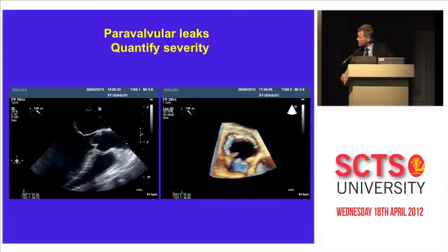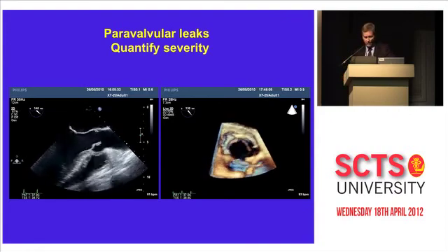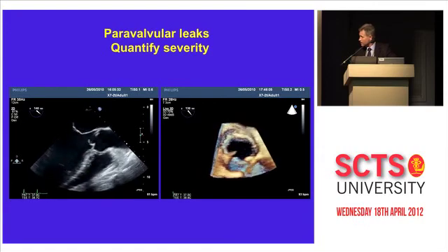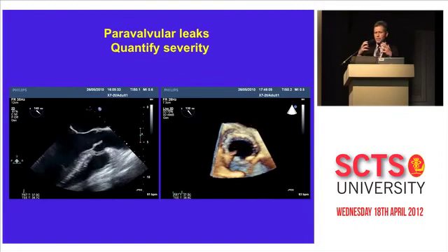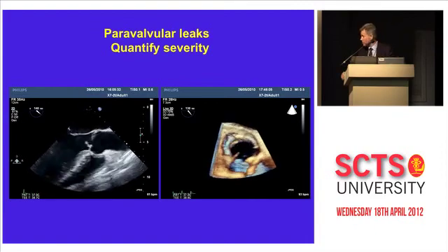I'm going to show you this case. It's a patient with previous endocarditis, prolapsing aortic valve there, almost destroyed, and the surgeon replaced it nicely with a bioprosthetic, stented bioprosthetic valve. Now, do not get confused, these are just the sinuses of Valsalva, and they have to be there because that is where, in diastole, the pressure builds up for the flow to go into the coronary arteries and to give your coronary perfusion.